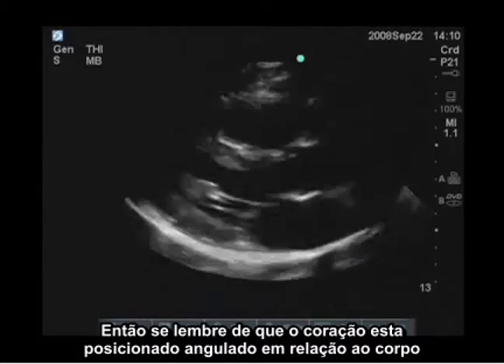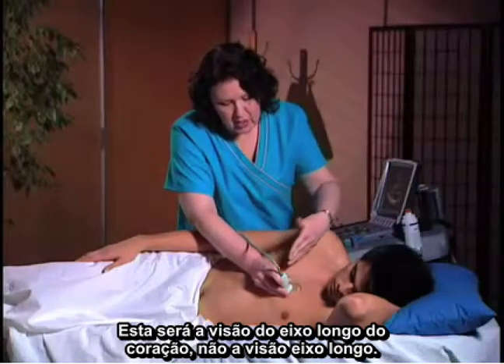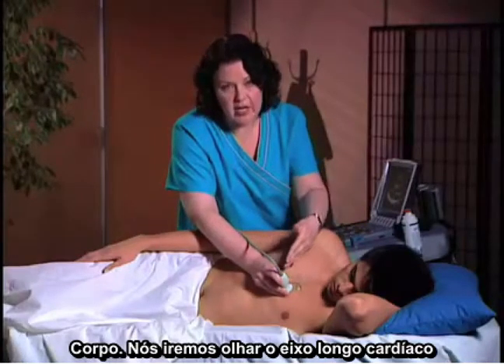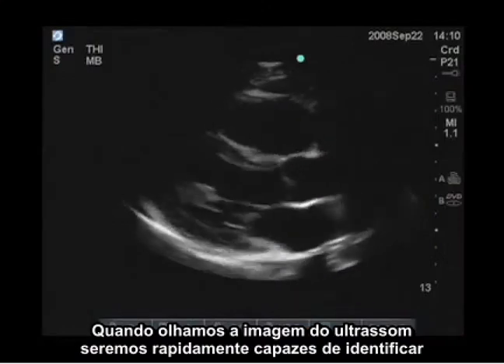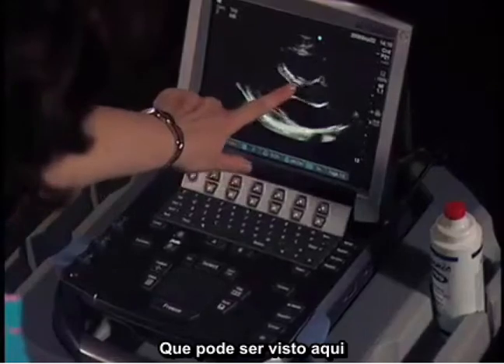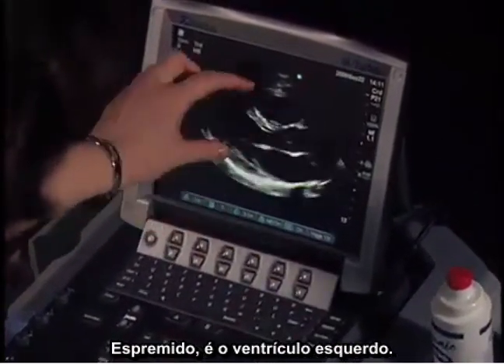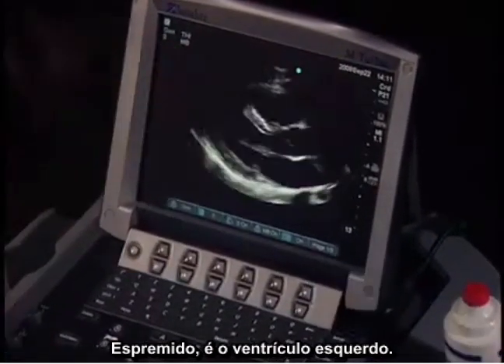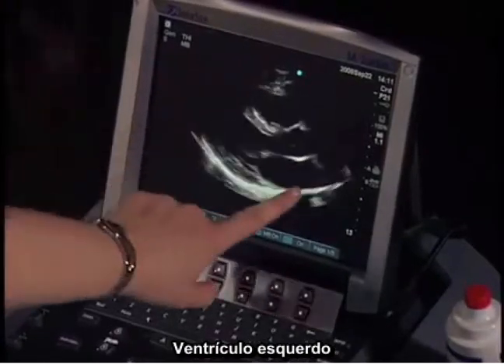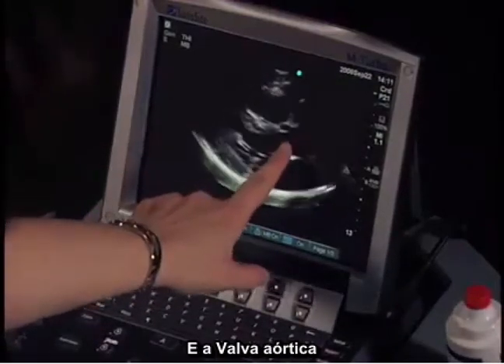Remembering that the heart sits in the body at a slight angle, this is going to be the long axis view of the heart itself — not the long axis of the body, but the long axis of the heart. When we look at the ultrasound image, we should quickly be able to identify the left ventricle, and what we're evaluating for is the squeeze of this left ventricle. On this image we have the right ventricle, left ventricle, left atrium, and the aorta, as well as the mitral valve and aortic valve.